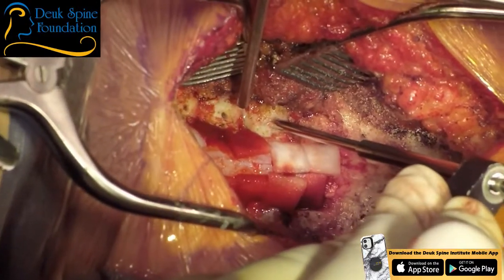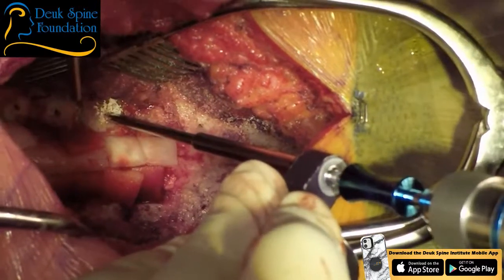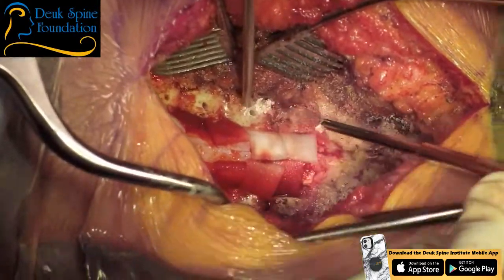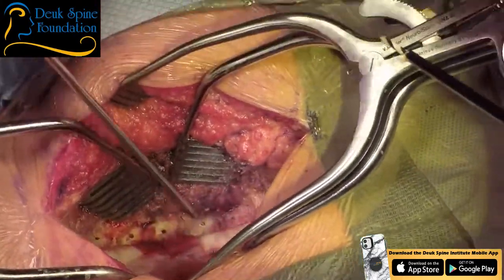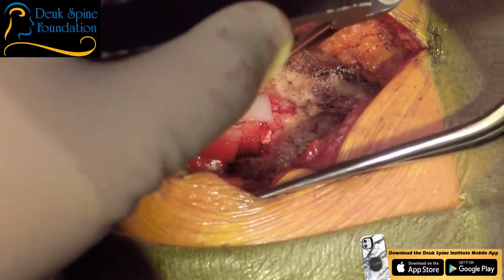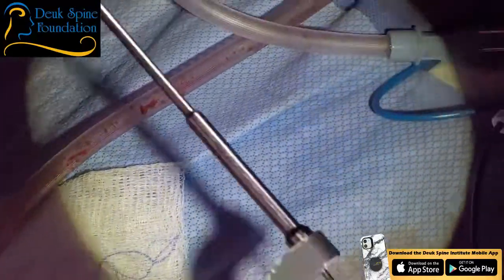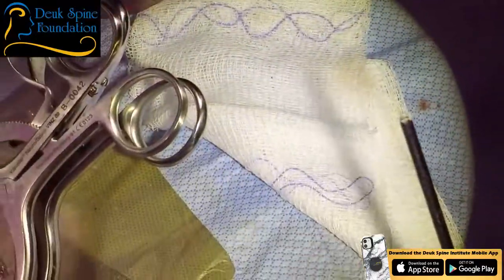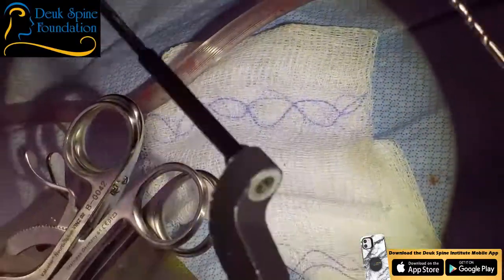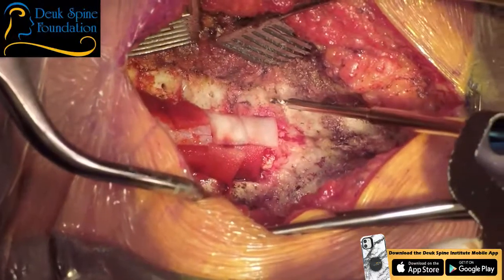Some people will skip one or two. That's fine. I don't. I like as many points of fixation as possible. More points of fixation mean a more stable construct. More likely it's not going to fail. At some point you may get some bone in there. It's better to just clean it out rather than be impatient, because it will affect the way the drill performs. And I've had it shift the drill bit out of alignment.